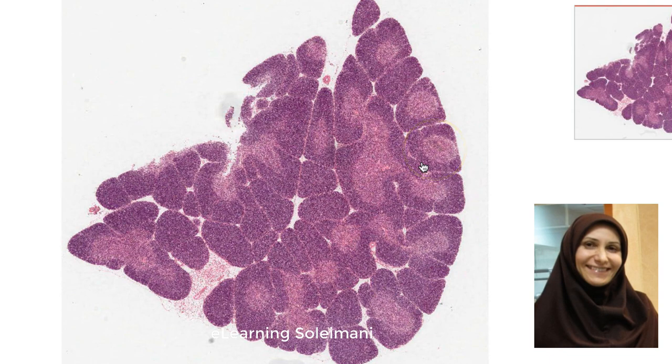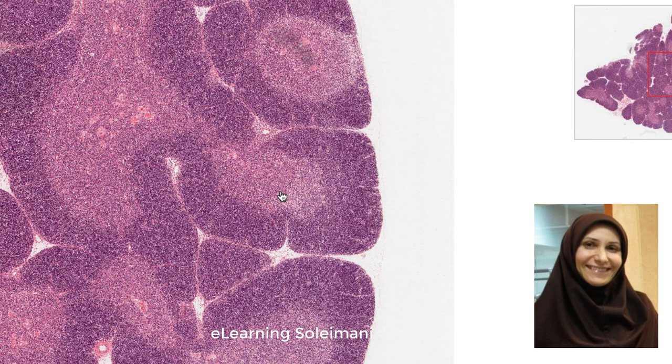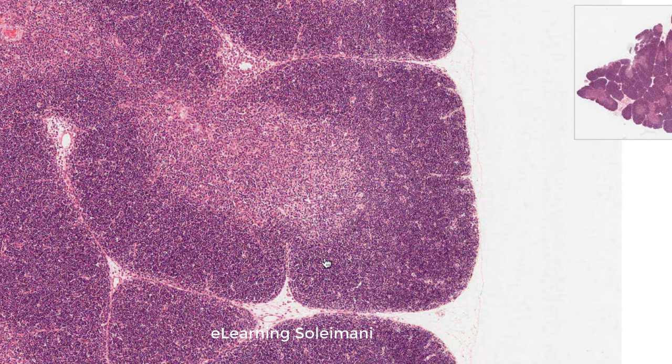There is a dark cortex and a lighter medulla in each of these lobules. With higher magnification, we can see the dark cortex with more detail. An aggregation of T lymphocytes migrate from the bone marrow to the thymus to undergo differentiation.